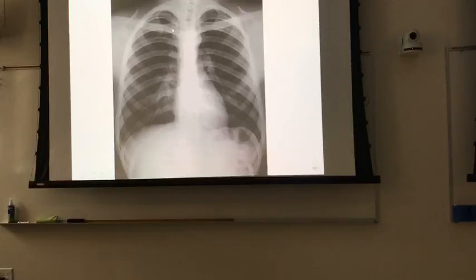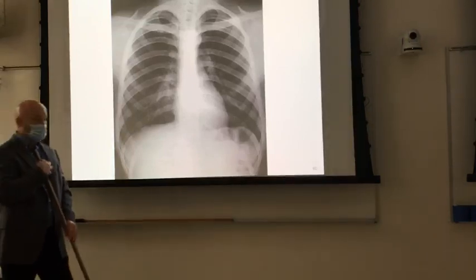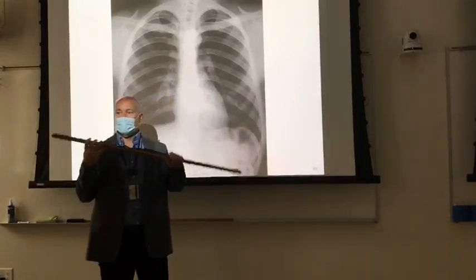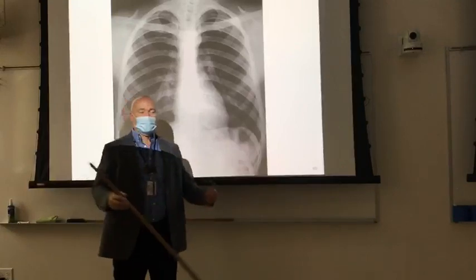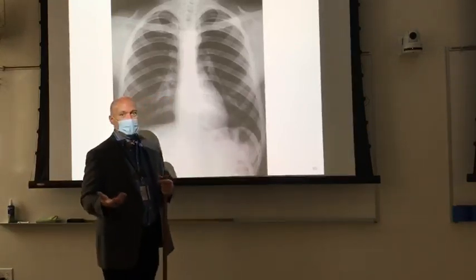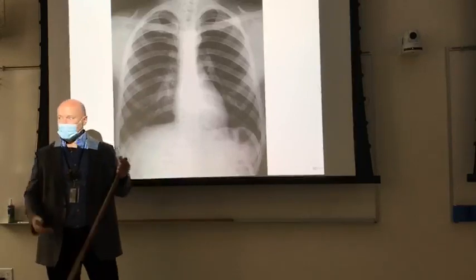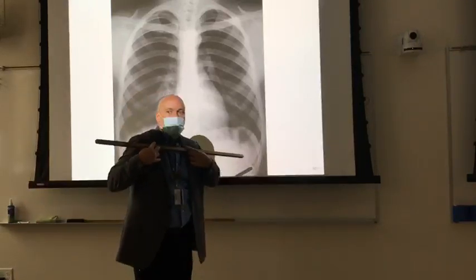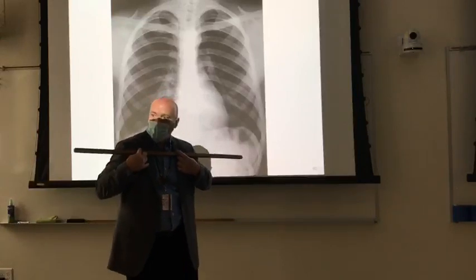Okay, so it's good. Now, if you don't rotate the patient's shoulders in, those clavicles are going to appear too high. Okay, so again, we took a look at the sternum. You rotate the shoulders in, the sternum becomes more vertical, but at the same time, you walk around with your shoulders like that, and what do we call that? Slouching, bad posture, right? So your clavicles are here, and if you do the same thing, you kind of see what's going on with the clavicles, okay?